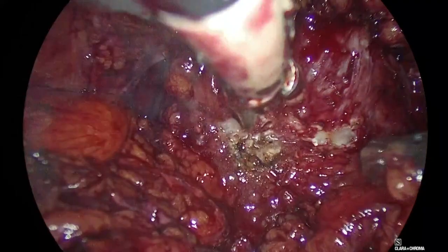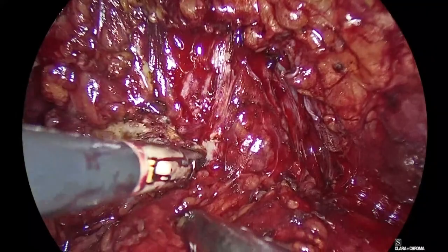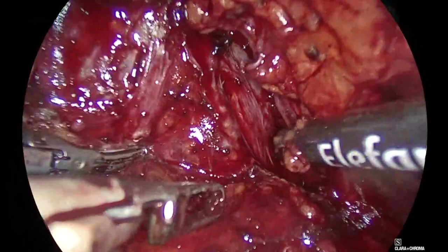Good. Right side. Stay here. Okay, you see this? This is the move. Blunt dissection down. Come close, Padeli. And then with your harmonic. Bleeding somewhere here.